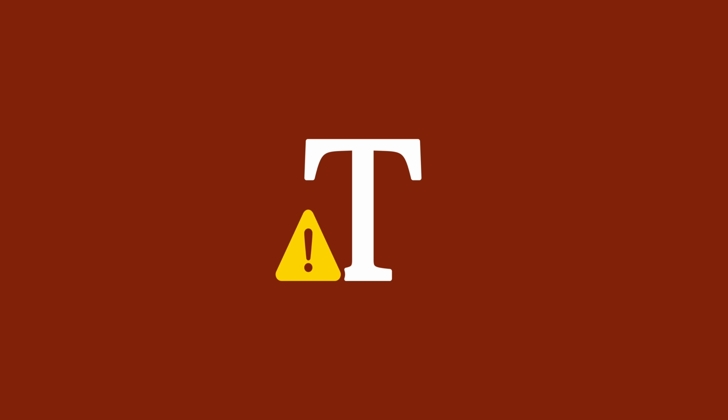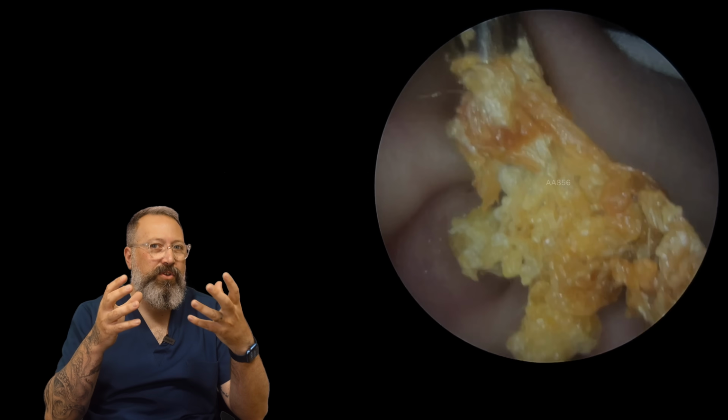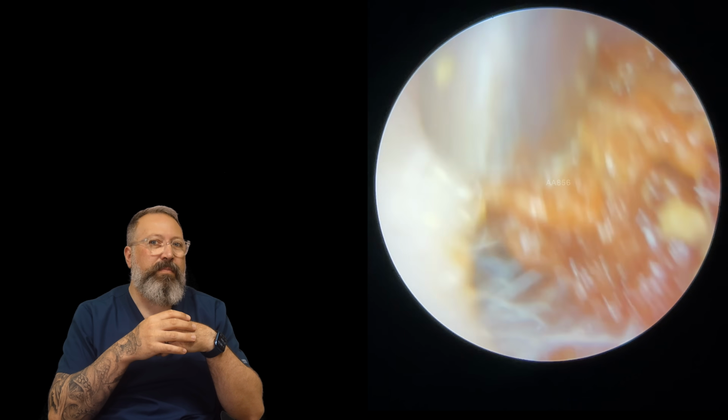So this isn't really keratosis obturans, all right? What you've got is a lot of keratin in this ear canal. It's not pressing against the canal wall. It's not kind of hardened up or solid. It's all very loose ribbons of keratin.